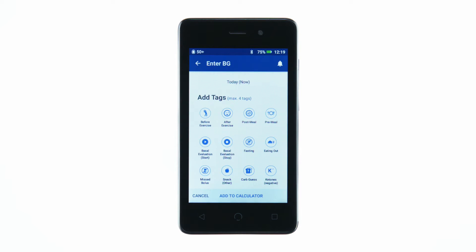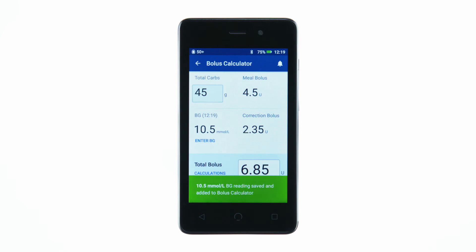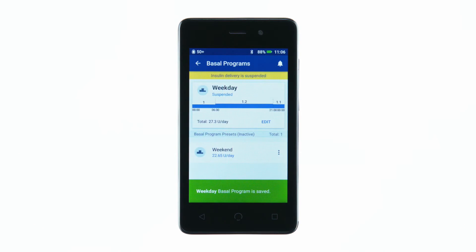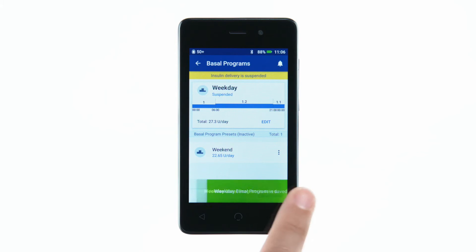During use, the PDM will also display confirmation messages with a green banner at the bottom of the screen. It will disappear after 5 seconds. You can swipe the banner to the right to dismiss it earlier.